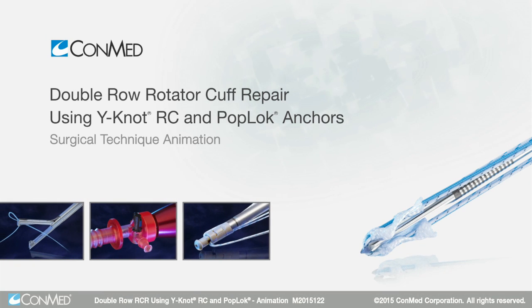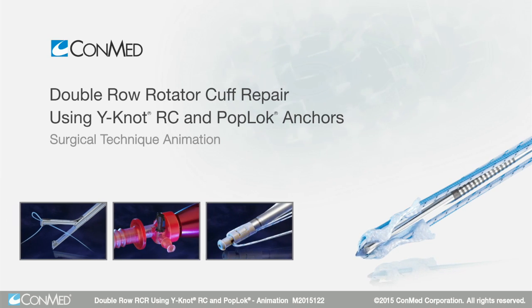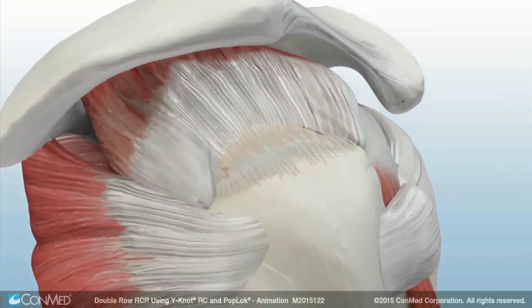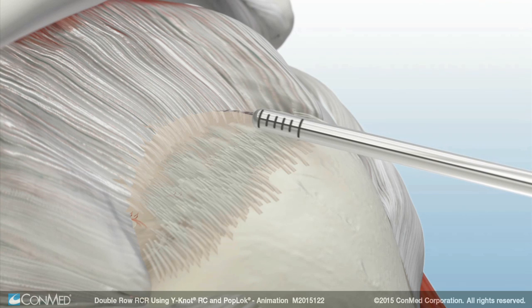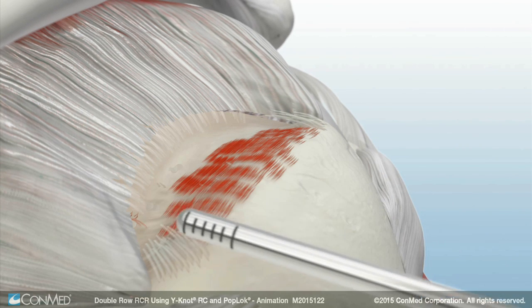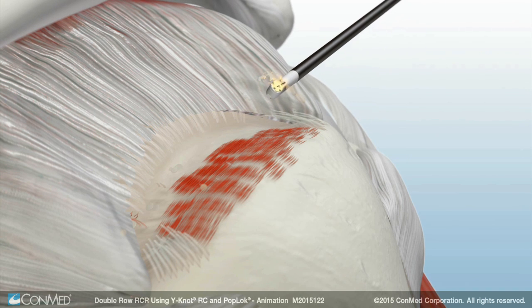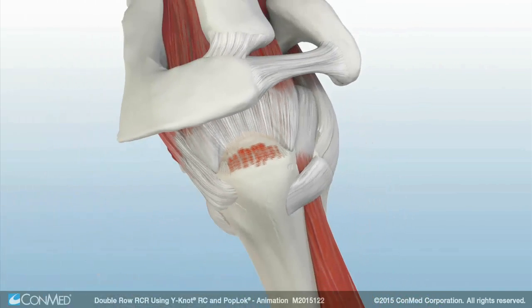The Y-Knot RC Self-Punching All-Suture Anchor and Pop-Lock Knotless Suture Anchor are used for secure double-row rotator cuff repair. To begin, prepare the footprint in subacromial space using a ConMed dual-purpose shaver blade and the Edge bipolar arthroscopic RF device.